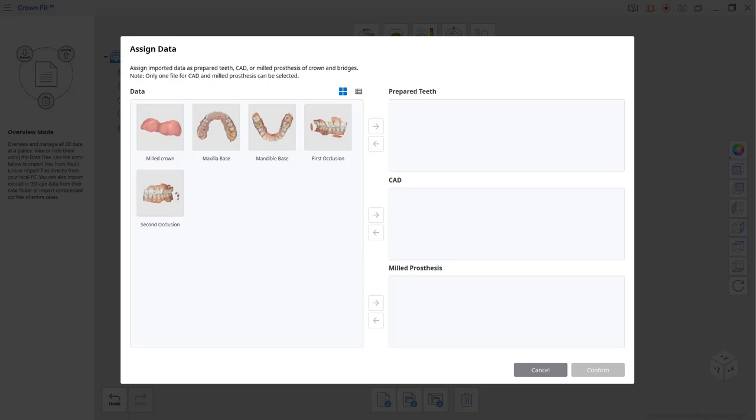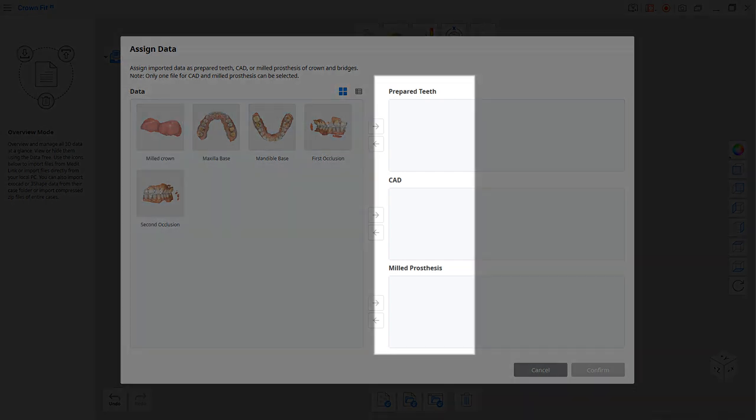To use the crown fit, you will need an oral scan, CAD data and milled crown scan data to proceed. If you do not have or cannot get the CAD data, you still can check the internal fit checkup without it.